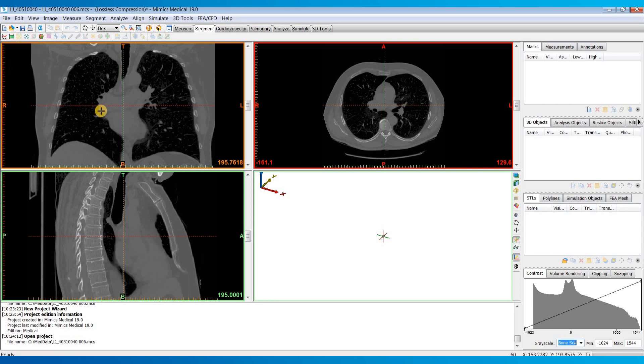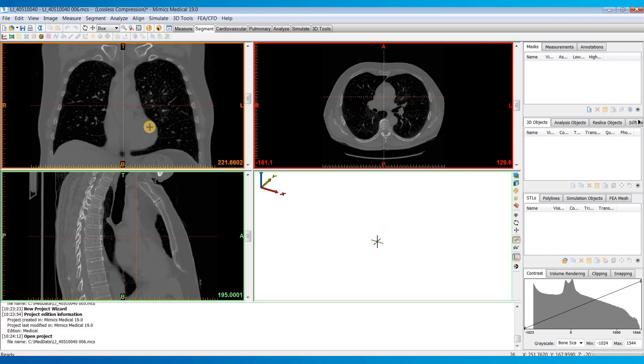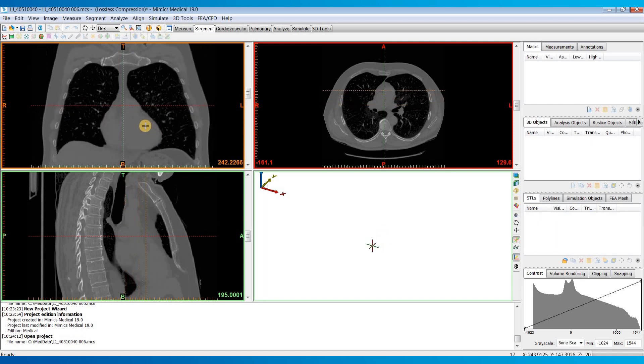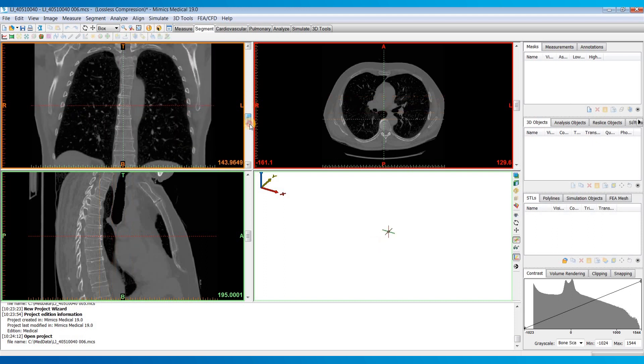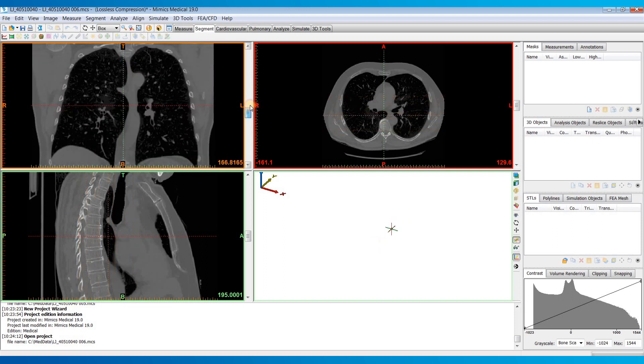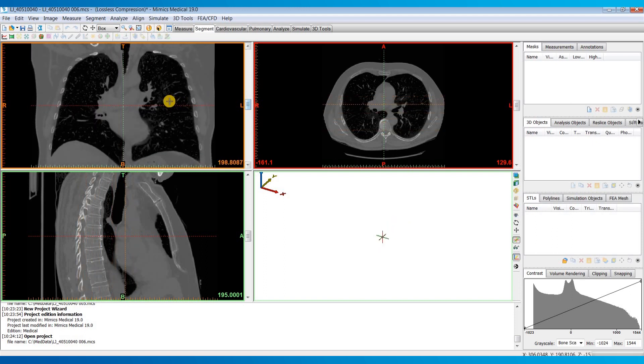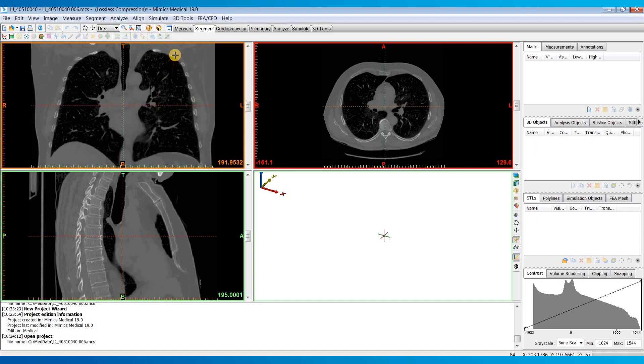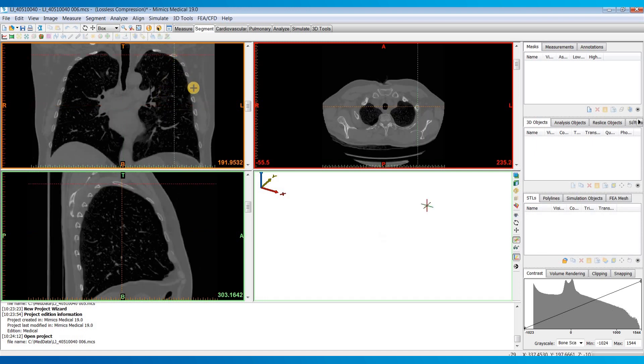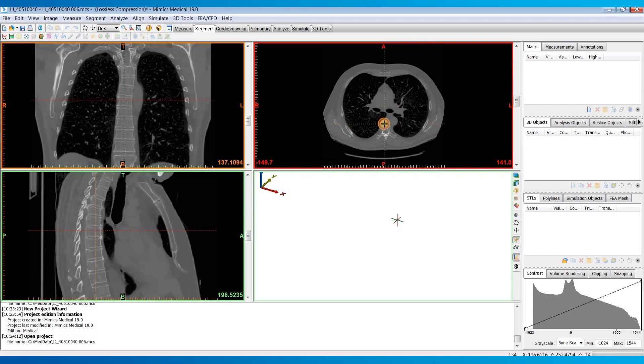To navigate through your images we can scroll through the images using the scroll wheel on your mouse if you have one, or you can also drag this slider on the right. To navigate you can also left click anywhere on your images and that will update your crosshairs and the two other planes to that location.